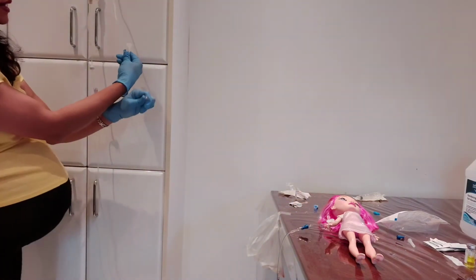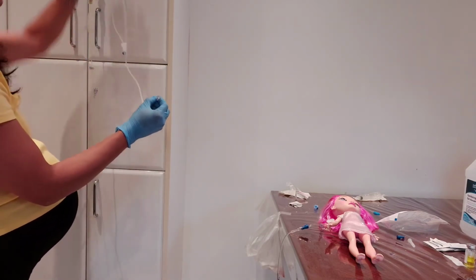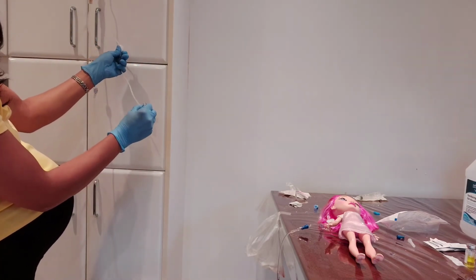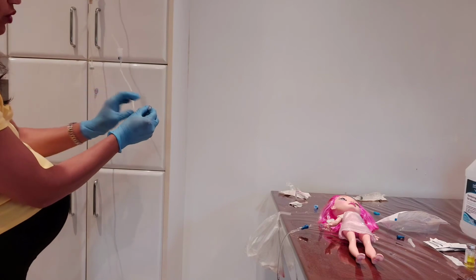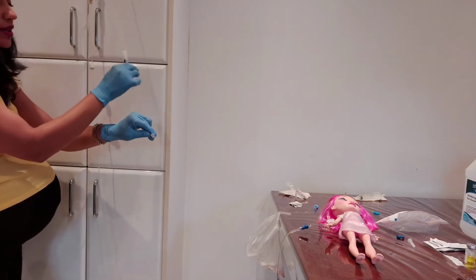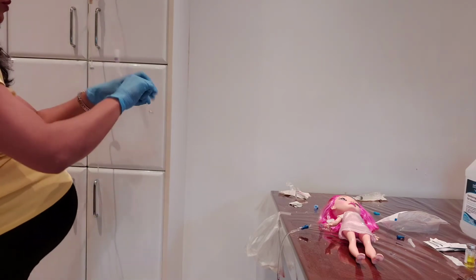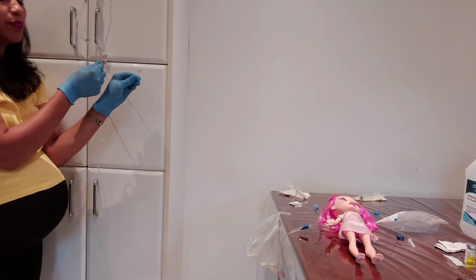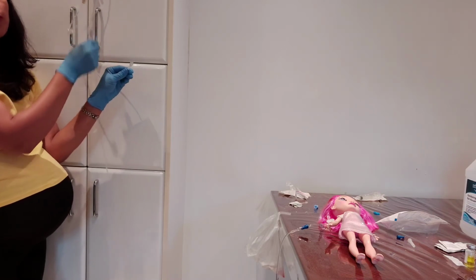I will open the clamp a little to make sure the medication is coming down. There is no blockage, no bubble. So I will open it a little until it comes. Yes, it comes. So I will close it again. Everything is okay, no blockage, no bubble. I will make sure that everything is going well. I have to connect it to the port that is near the primary bag.